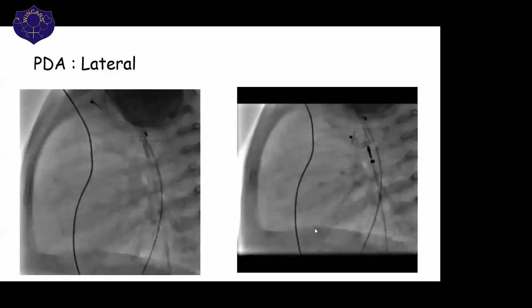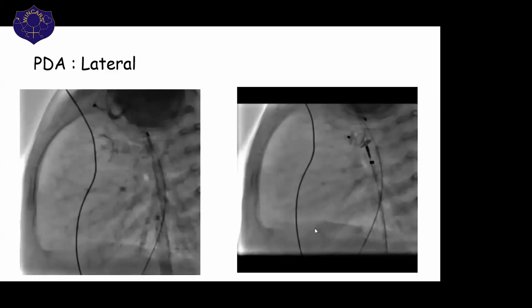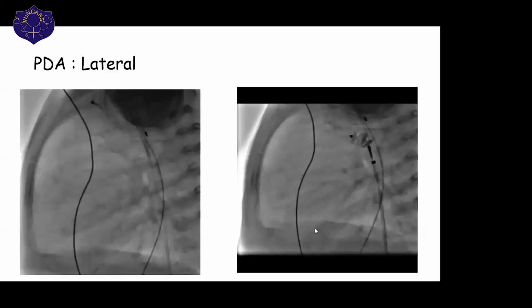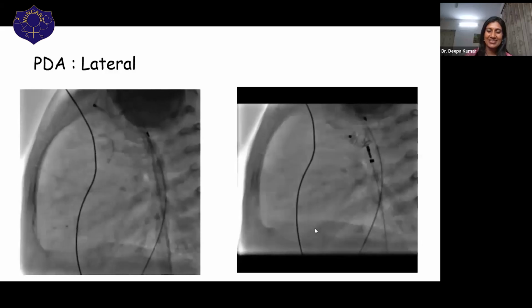So there are A, B, C, D, E. Now E also, isn't it? F as well. E, F, sorry, F also. Yeah, I think one person has got it right. Someone has written it's a vascular plug.